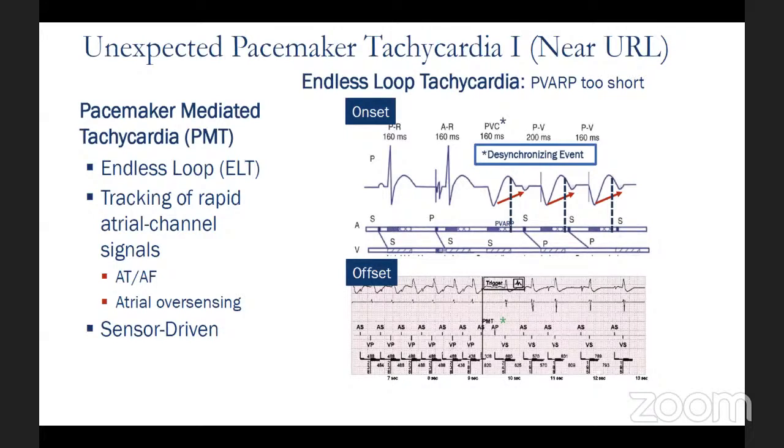These are rare. For the MVP, honestly, in our center, we nowadays don't use that much because of the confusion that happens around it. We received lots of calls about those cases. It helps to some extent, but in our pacemaker clinic, we tend to use them very minimally, as you said, Mohammed, to young patients or patients who can't tolerate pacing.